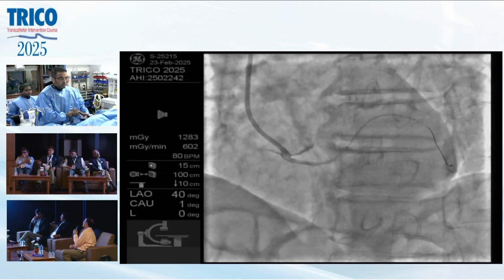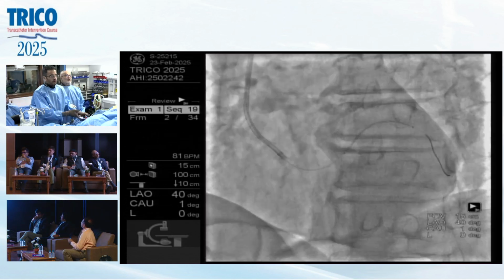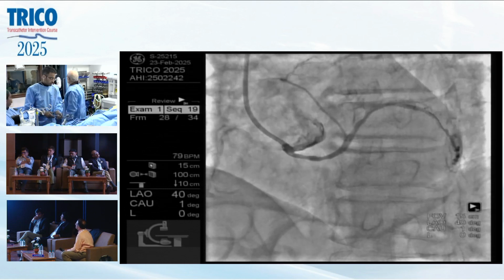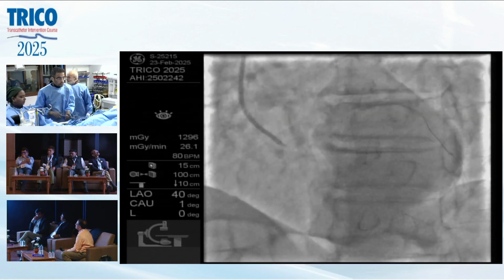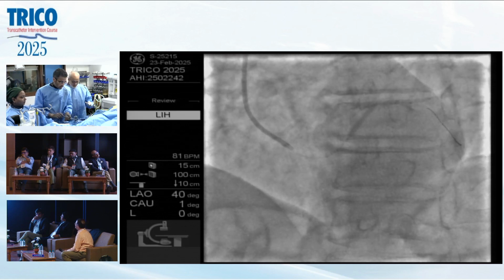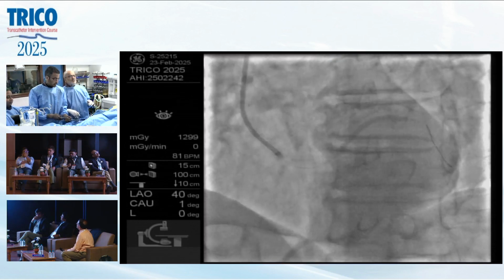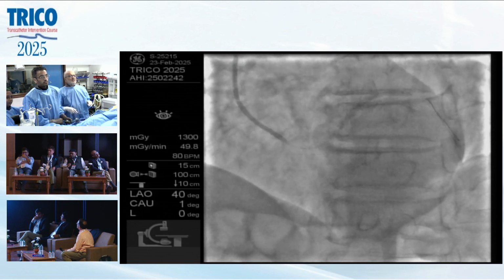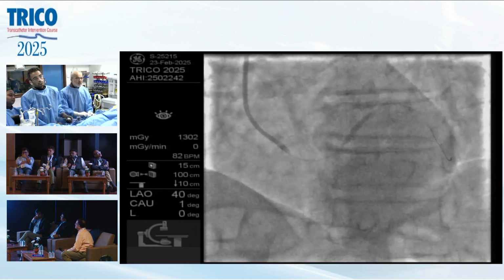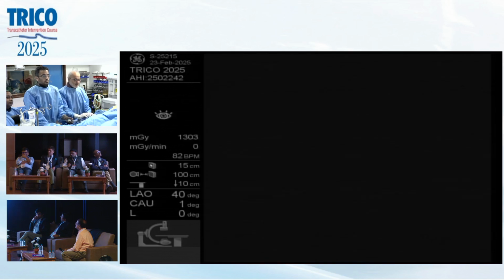Dr. Akasaka, this looks perfect. You can go up to 10. I'll get the answer. Yeah. Go. 10, 11, 12 here. Wait. Record. A little bit back.